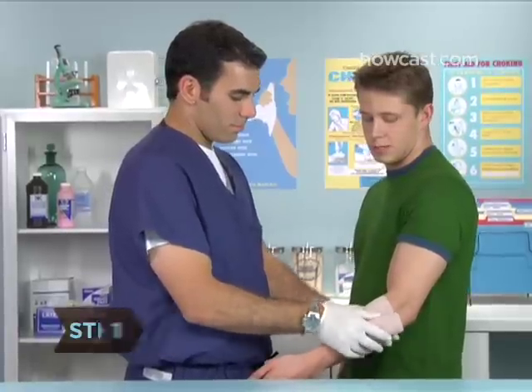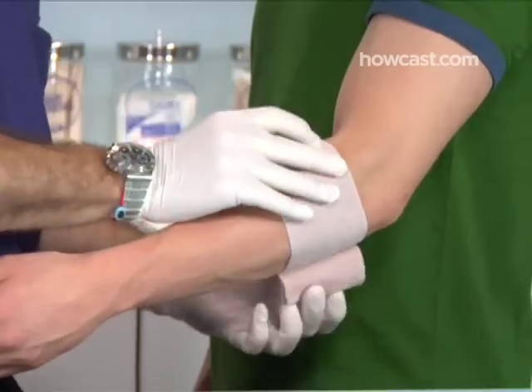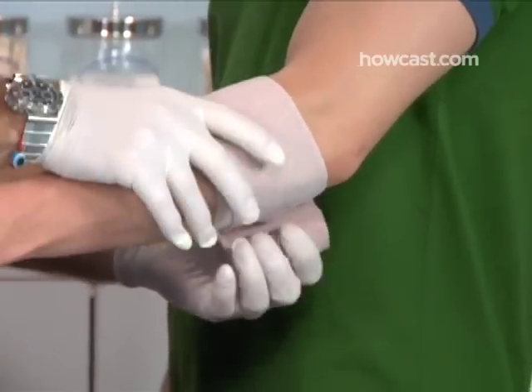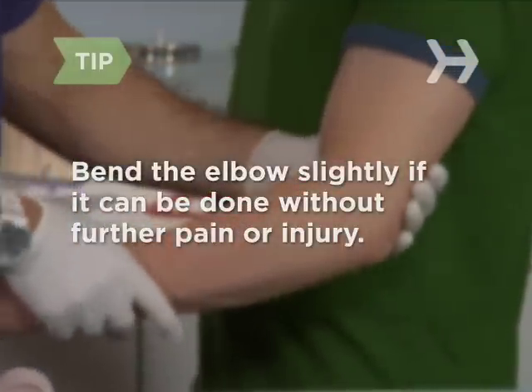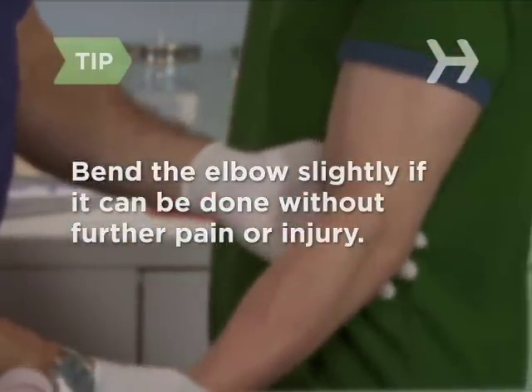Step 1. Place the tail end of the bandage on the inside of the arm, just below the elbow, and wrap it around the arm twice to secure the bandage. You want it tight enough to apply pressure, but not to cut off circulation. Have the victim bend the elbow slightly if they can do so without causing further pain or injury. This positioning will make the bandaging easier.